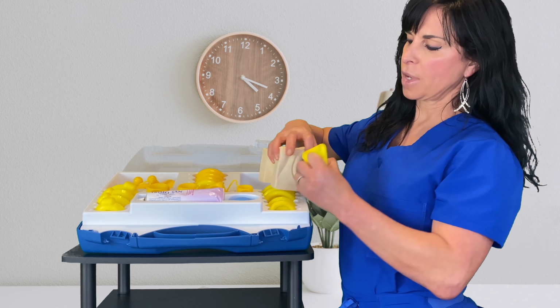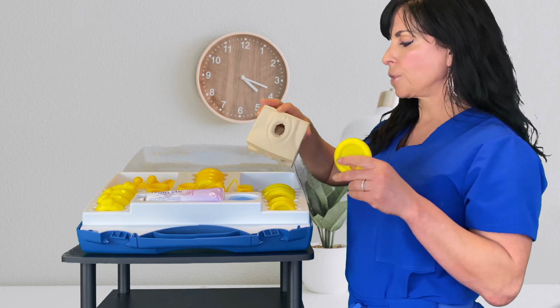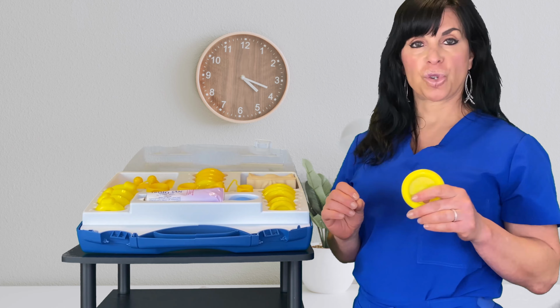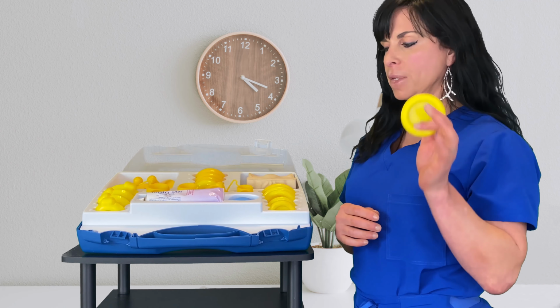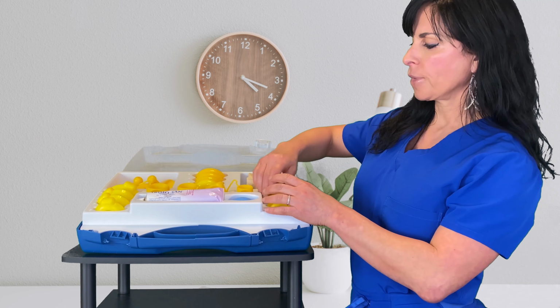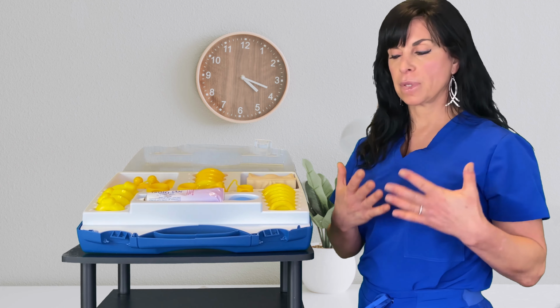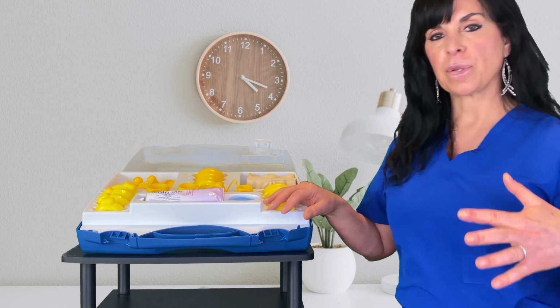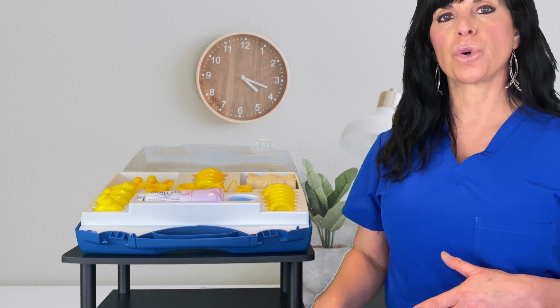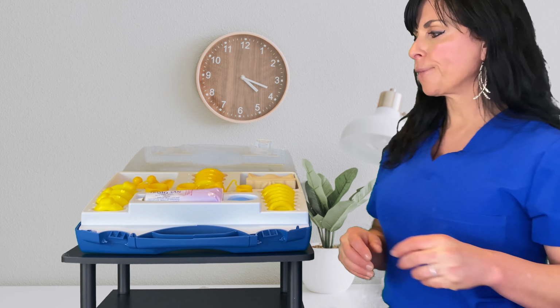And usually it's not too difficult. Some of the tricks that women will use is that they will push, as if you're pushing a baby or pushing a bowel movement out, so that you can get it out more easily. Some positions that will help you to put it in and take it out would be to place your foot on a step or a stool, so that it kind of opens up the vulvar area.